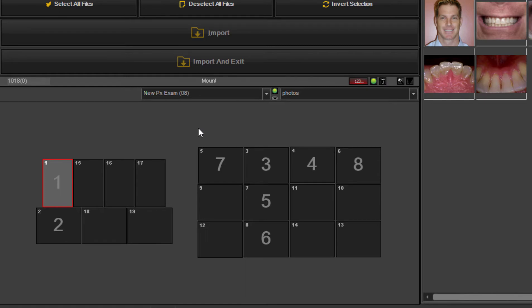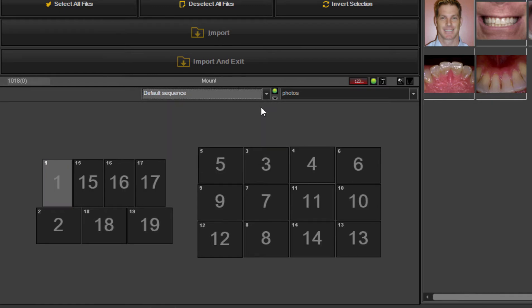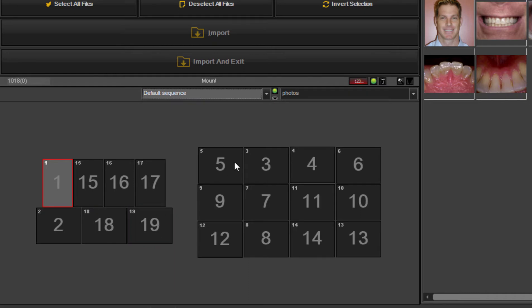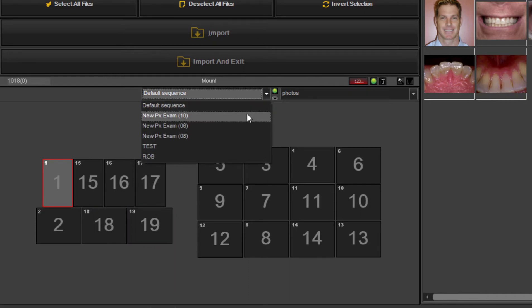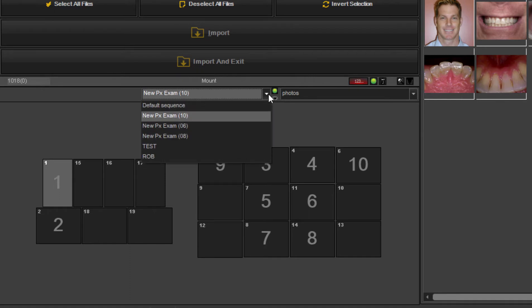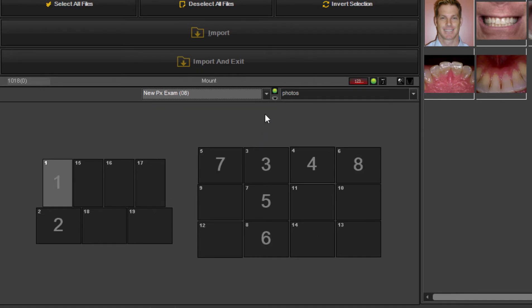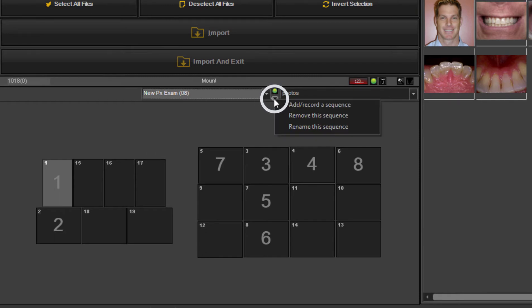So we have created already some templates that has a default sequence, which is all 19 images. We have a 10 image sequence, we have a six, eight, and then it's very easy for you to create your own by just clicking on the small arrow below the green dot.